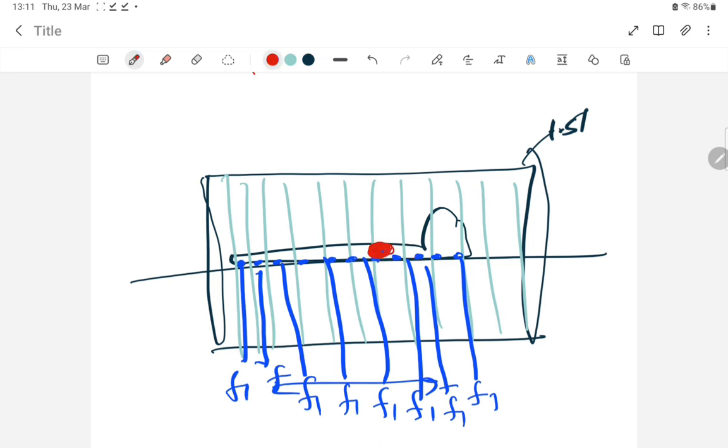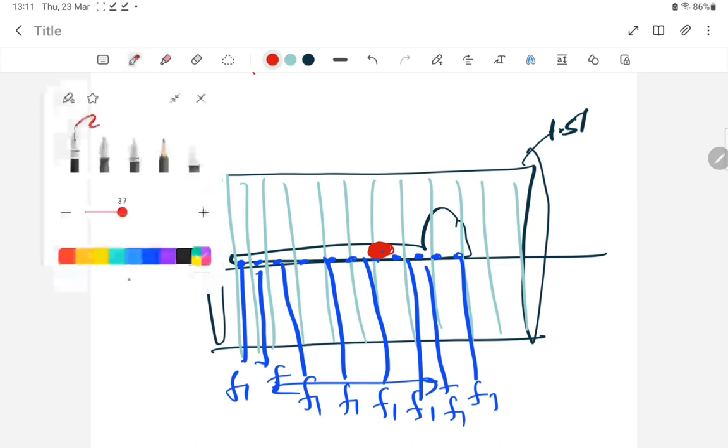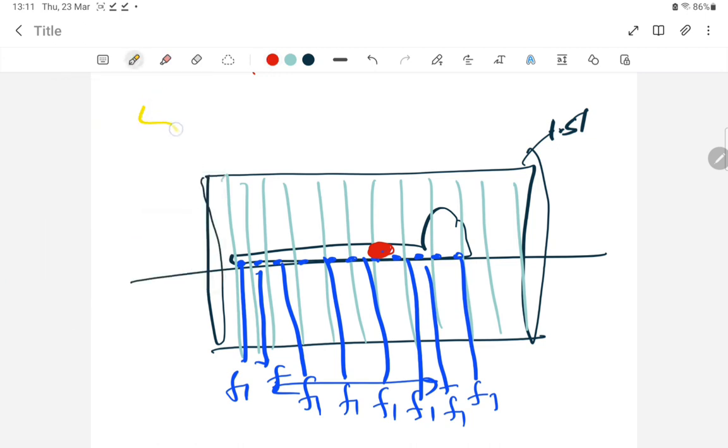This is a very important point. Now from the outside source, we are giving an RF energy to flip the hydrogen atoms. We are giving RF, an electromagnetic wave, to the patient body, because we want to see the tumor, we want to do the scanning. This patient's entire body is in 1.5 Tesla. Frequency is the same. Everywhere it is F1 frequency.